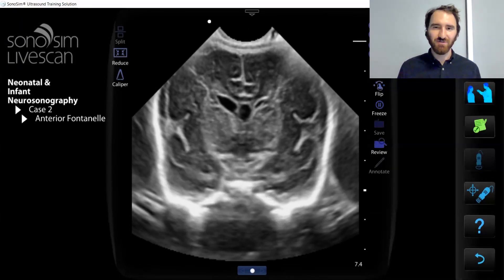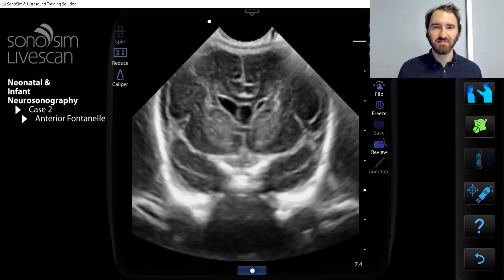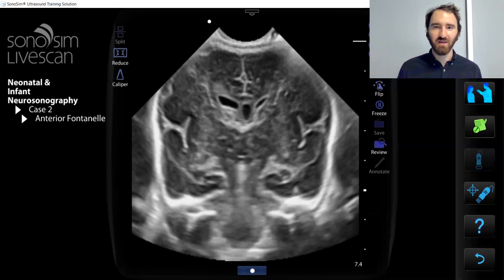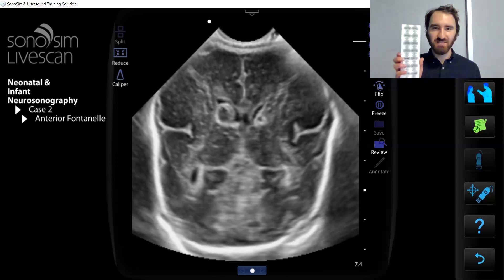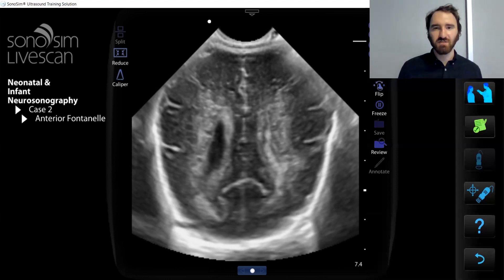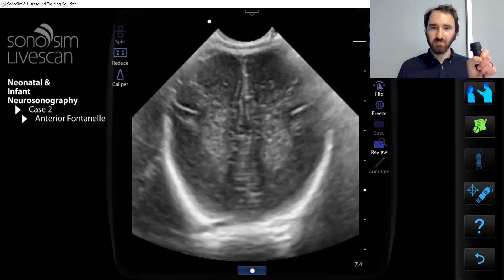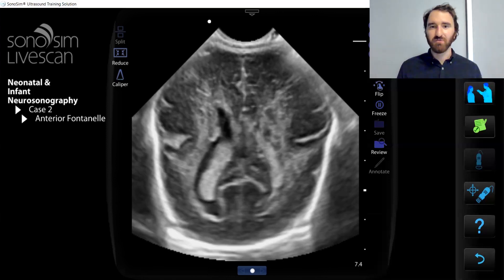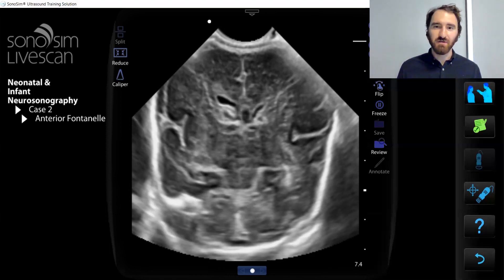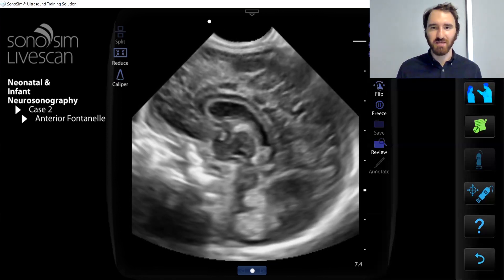To run your remote simulation, you will need four things. One, your SonaSim LiveScan tags. Two, a SonaSim LiveScan probe. Three, a computer. And four, a mock ultrasound patient.